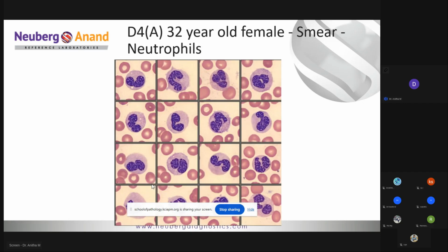And as Dr. Leah mentioned, these are definitely dysplastic neutrophils. As you can see, there are no granules at all. But surprisingly, almost 50% of responses had given this out as even normal neutrophils. I think my colleagues usually tell that to get used to digital morphology, it's slightly tougher. So I think since we are more used to digital pathology, we are able to appreciate this well.